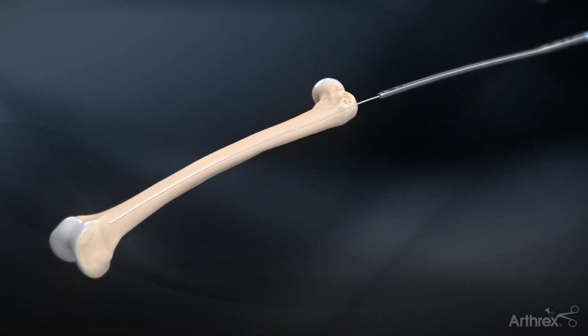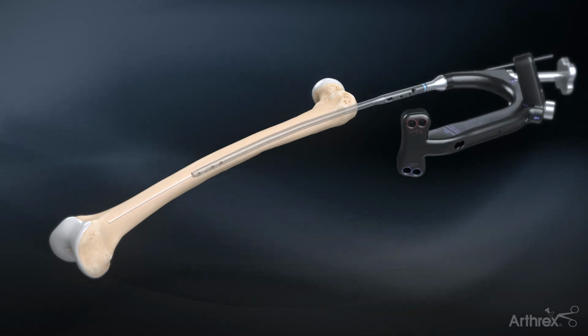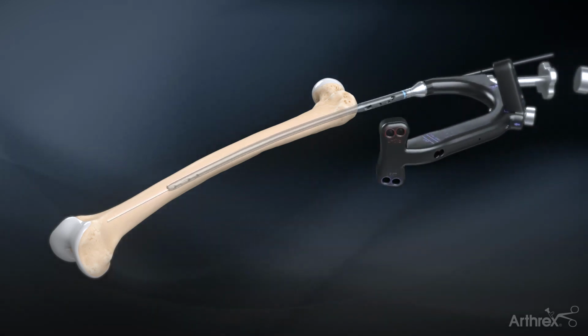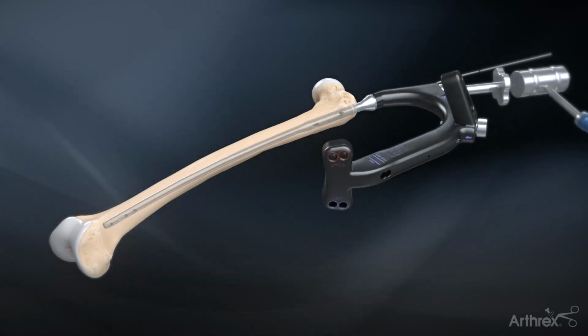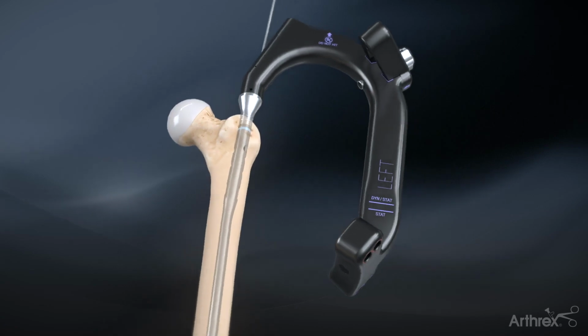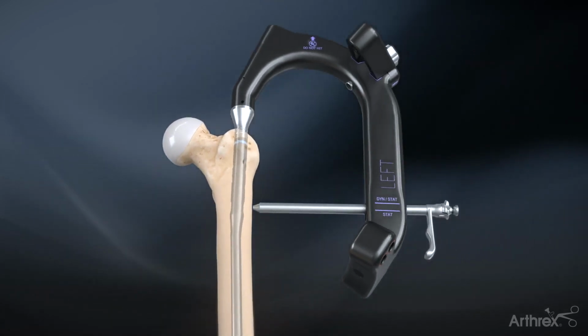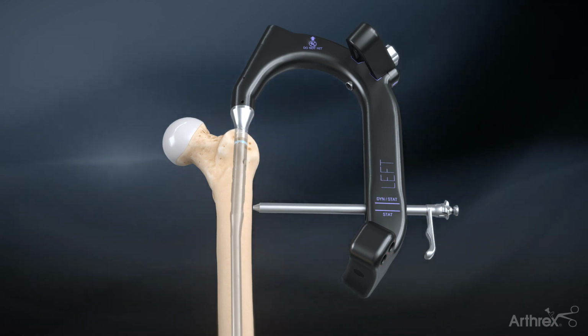Introduce the nail into the femur over the ball nose guide wire. Complete the insertion with gentle mallet strikes on the targeting guide impactor pad. Remove the ball nose guide wire and slide the screw sheath, 4 mm drill guide, and 4 mm obturator assembly through the appropriate transverse hole in the targeting guide until it contacts the lateral cortex of the bone.